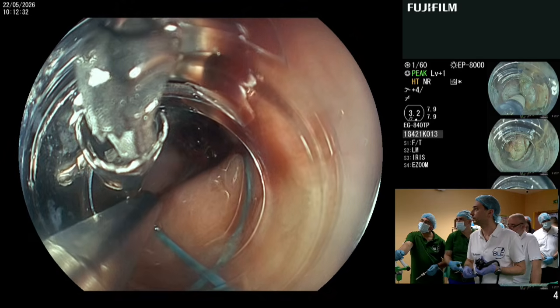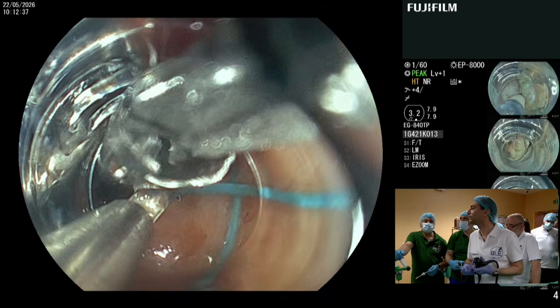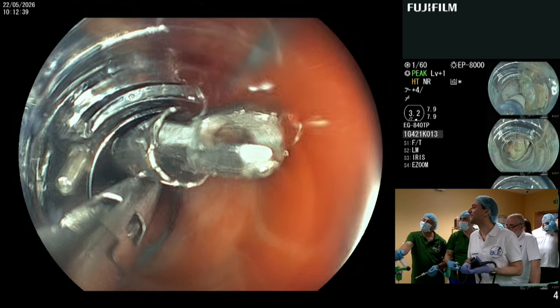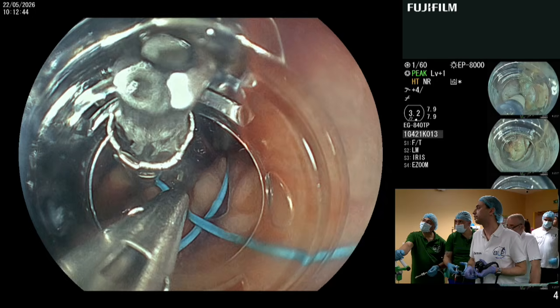Okay, open. You have enough clips for the other procedures? Yes. Close. Okay, now it's good. Yes, good. Fire. Fire? Yes.